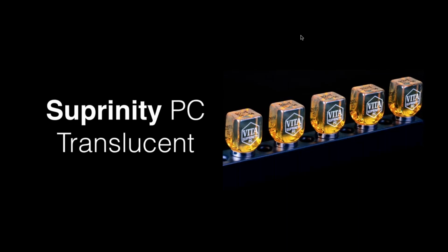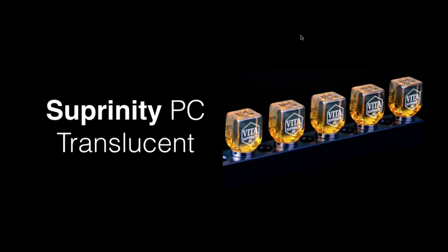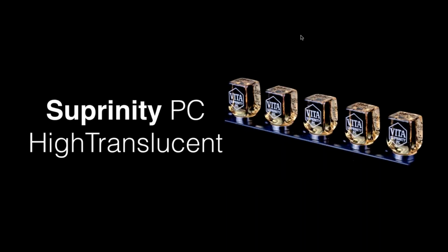These materials come in different levels of translucency. We have the conventional translucent and the high translucent. This is nice because, as you saw in the last case, maybe sometimes we want a little less translucency, which with feldspathic ceramics is not possible. It's too translucent. There's a lot of glass in there. So with this type of material, we have this flexibility between translucent and high translucent, and in the biggest percentage of cases, I actually go with the translucent.